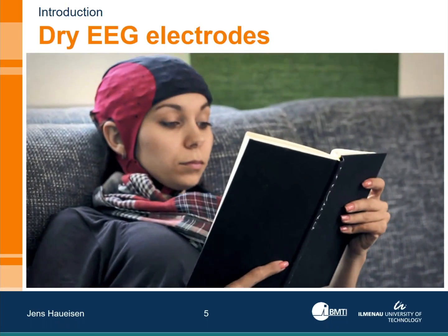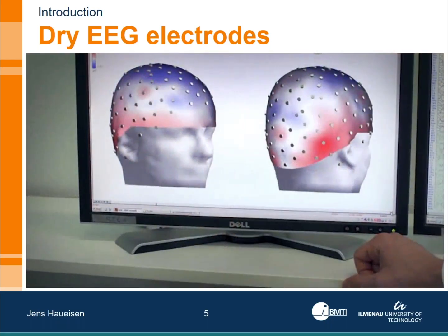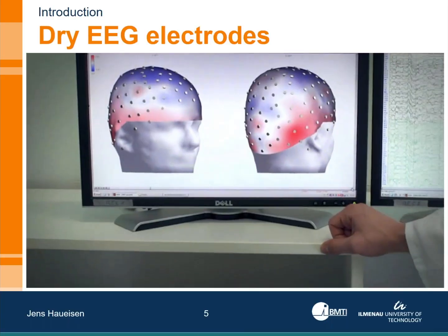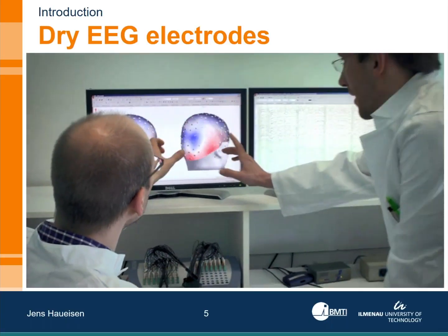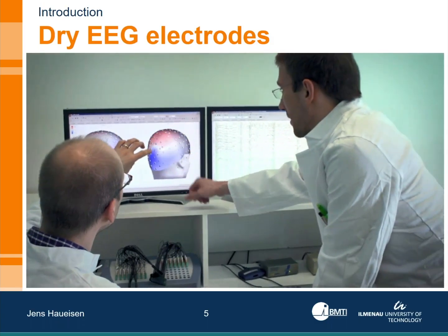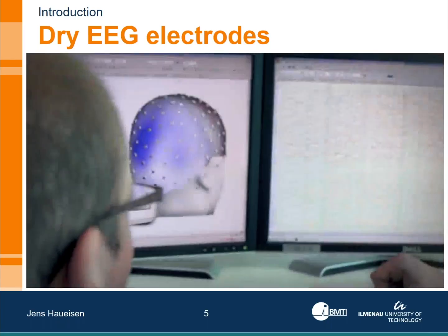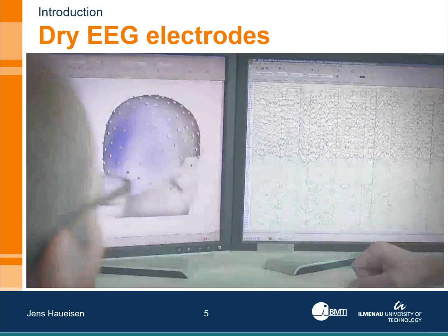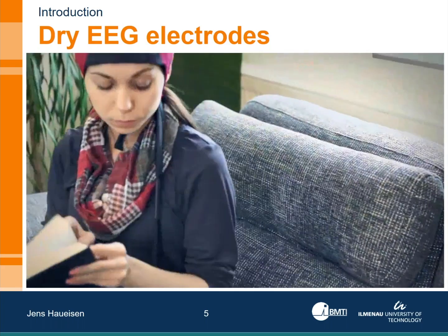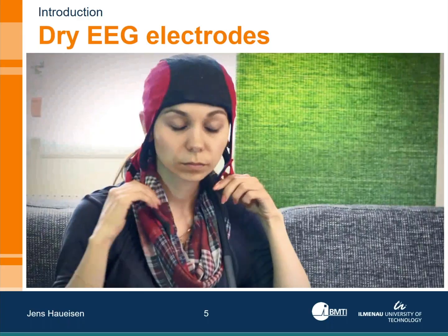This opens the door not only for much faster EEG recordings, it opens also the door for telemedicine applications relying on EEG. So you can think of many different aspects where you want to monitor patients at home or in some other remote place and have the analysis of the EEG, the interpretation of the EEG, done at a completely different place.